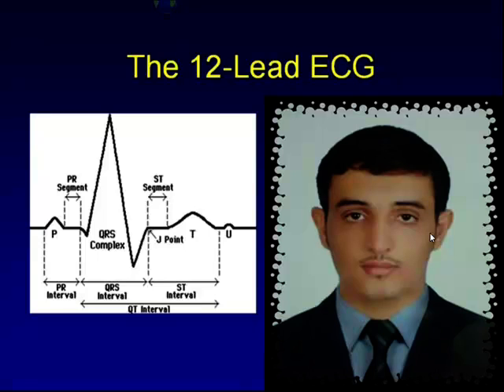Actually, today we will continue our lessons about ECG interpretation. Today we can speak about the 12 leads of ECG and how we can interpret them and look into the heart from different directions. What does that mean? Actually, the heart is an object in the middle of your chest, somewhat to the left more than to the right, but actually you are looking at the heart from anterior, lateral and inferior and so on. Horizontally and vertically, all these leads we can interpret very precisely.